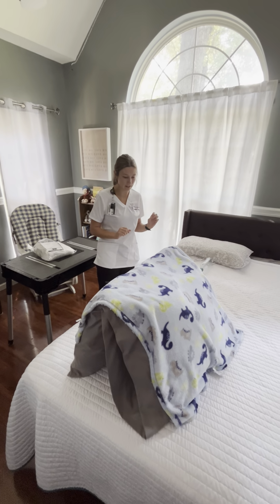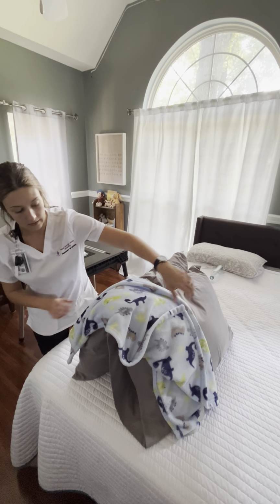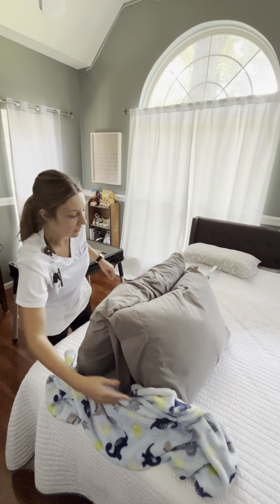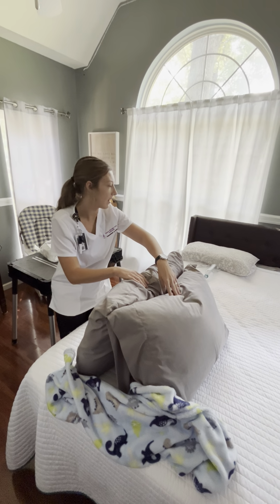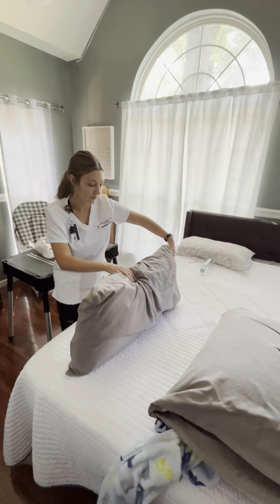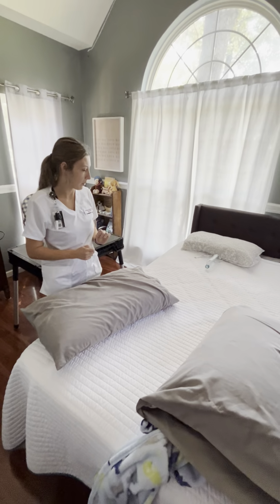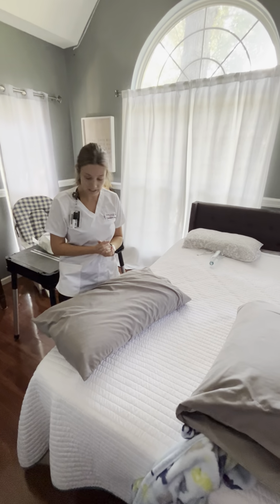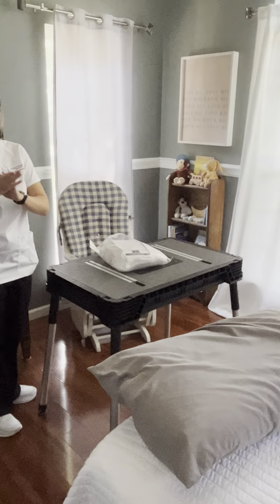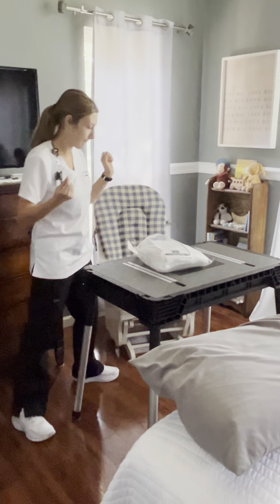So I'm going to go ahead and remove your blanket. And I'm going to have you spread your legs to the side. Ankles not touching. Perfect. I'm going to go over here and get everything set up for your Foley. Before I touch my kit, I'm going to do hand hygiene again. Perfect.